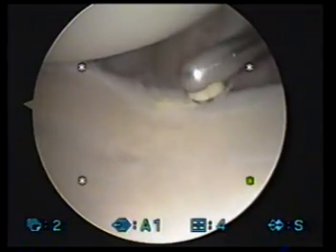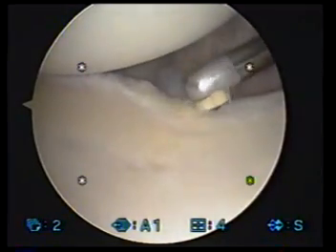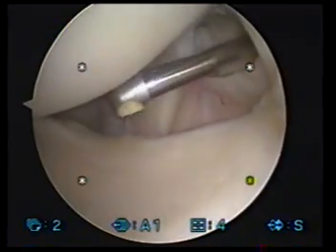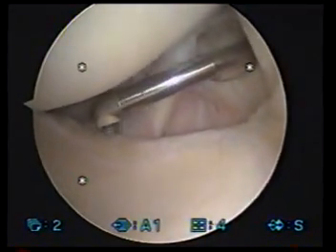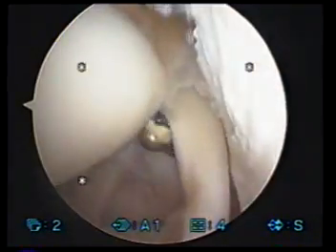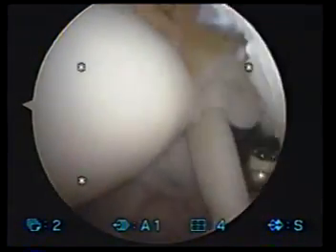We do that as we use this little electrosurgical tool. It ablates the damaged tissue. It gets safer right up here where the biceps had some fraying right there, and you saw that. That's where we're going to fix the rotator cuff.